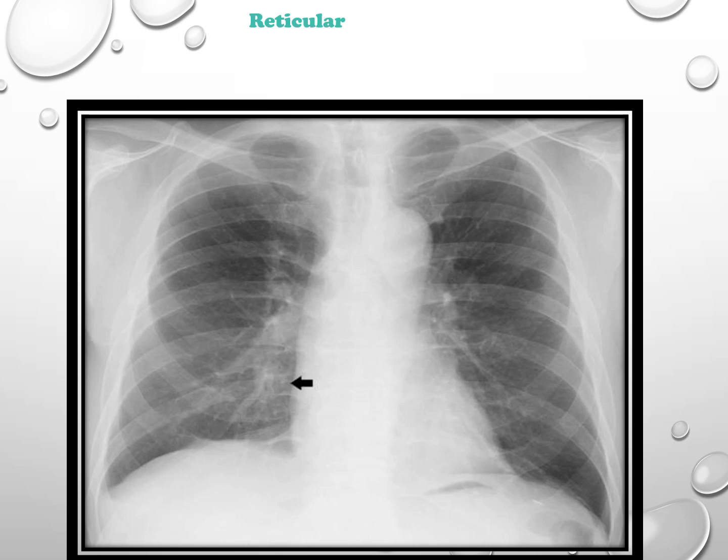This chest x-ray reveals tiny, granular, reticular shadows located in the lower right lung field. It is commonly found in conditions such as interstitial pulmonary fibrosis, collagen vascular disease, and asbestosis.